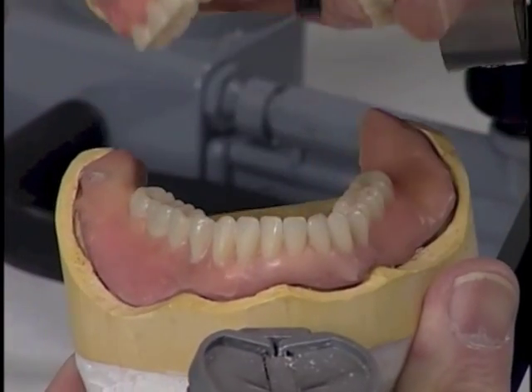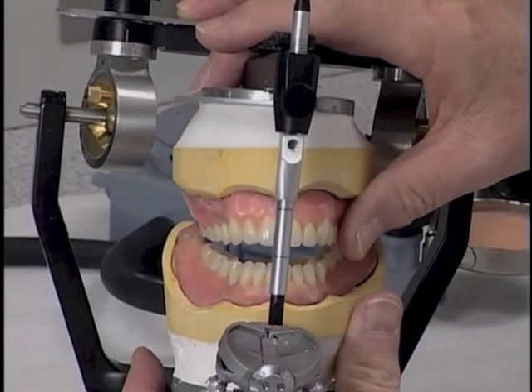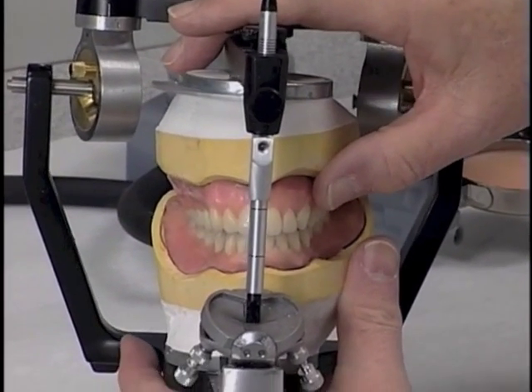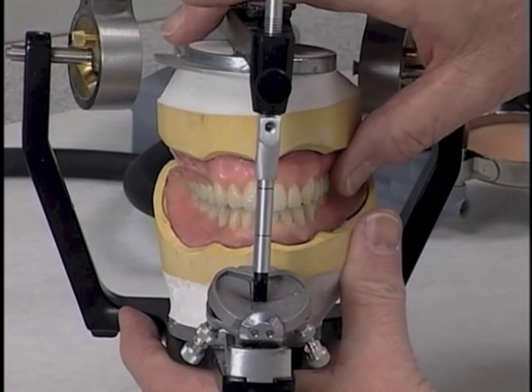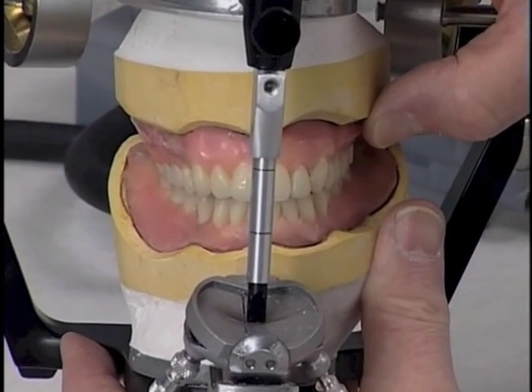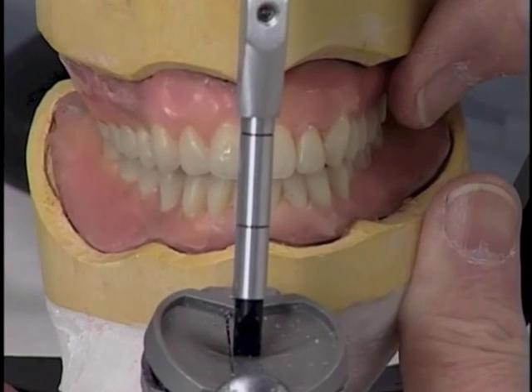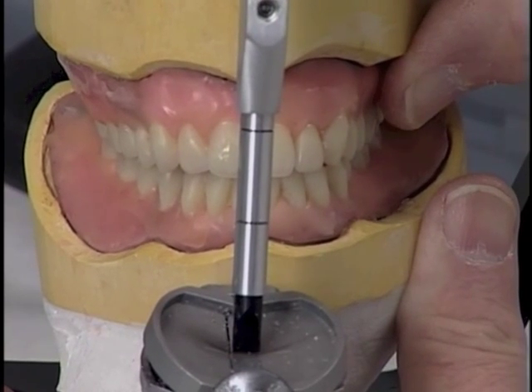As we can see, this is a little more difficult to do than the other two types of occlusion that we've discussed, such as lingualized or flat plane occlusion. It can give a very nice aesthetic result, and this type of occlusion we use primarily on patients with fairly good ridges and fairly young and well muscularly coordinated. And those types of patients appreciate this type of occlusion.